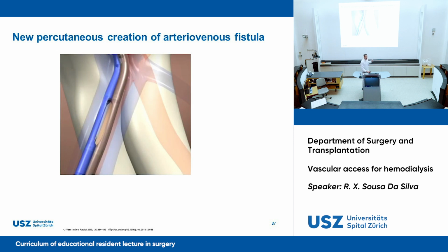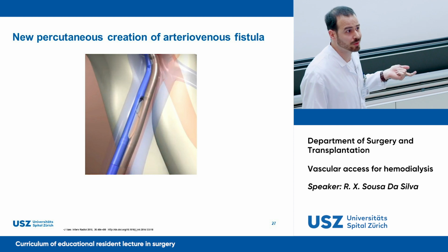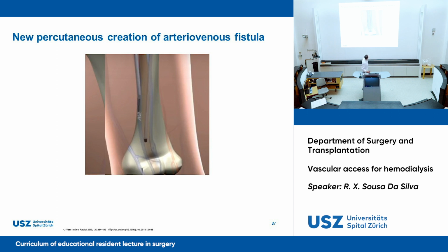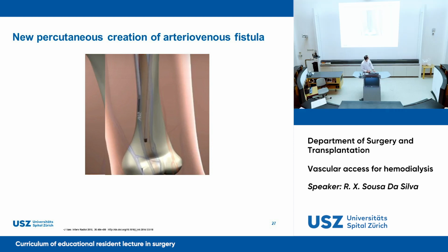They are magnetically guided. When you control on angiography the correct positioning, an electrocautery comes out and makes an incision, creating a hole, and thus creating an arteriovenous fistula. Then when you leave, you additionally put a coil, or you just close this brachial vein, so the backflow is less.